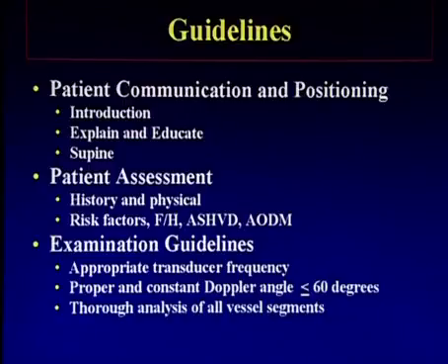Next, the patient assessment section, and that's when you perform your history and physical, when you look for any risk factors, you ask the patient if they've had this type of examination before, you look for those findings, and you find out if they have any surgical interventions that you may need to know about prior to starting the exam.